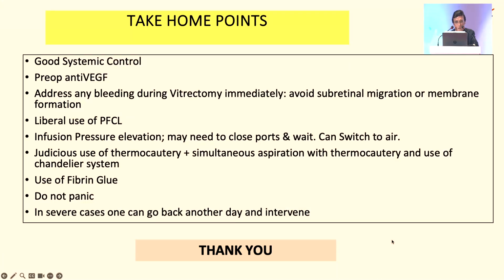patient did well. So take-home points are good systemic control, pre-op anti-VEGF injections, address any bleeding during vitrectomy immediately, avoid subretinal migration or membrane formation, liberal use of perfluorocarbon liquid, infusion pressure elevation, may need to close ports and wait, can switch to air if required, judicious use of thermocautery, simultaneous aspiration with the thermocautery, so you have to have a bimanual system.